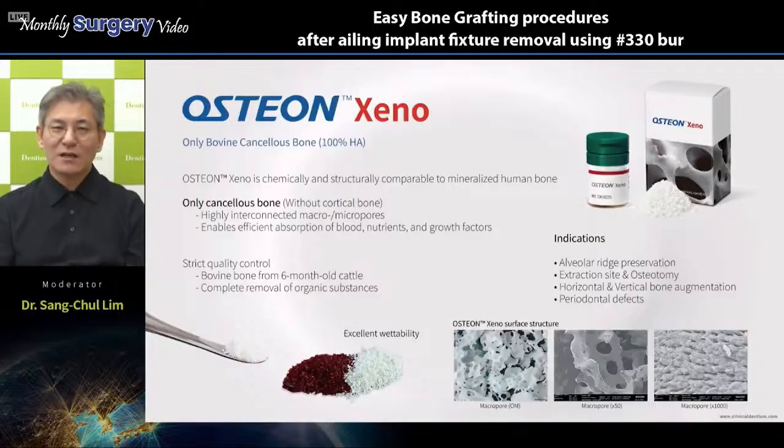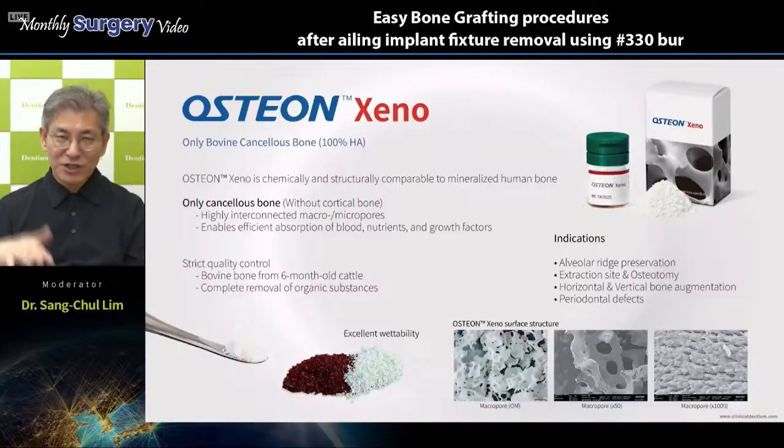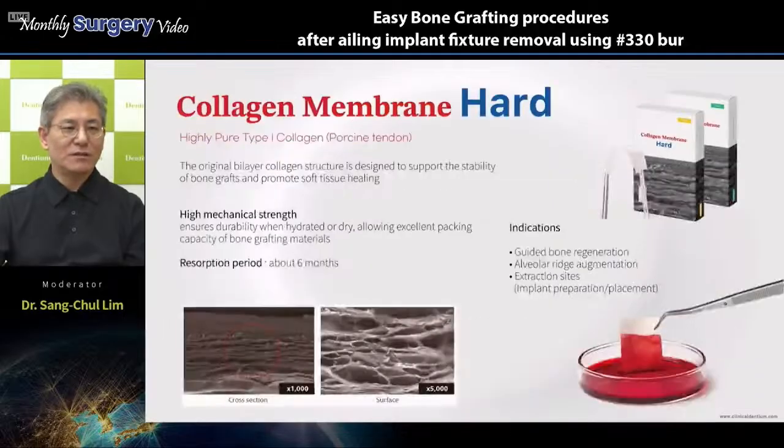So it is easy for bone cells to nest and stabilize, and vascularization is faster. Finally, we get new bone formation faster than with any other xenograft material.